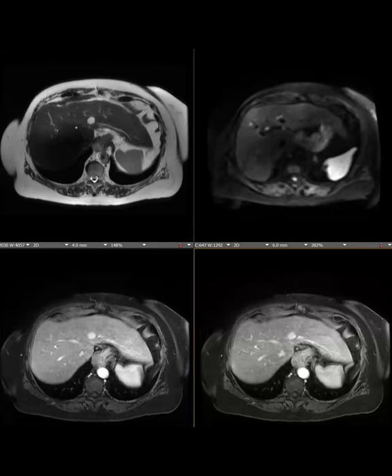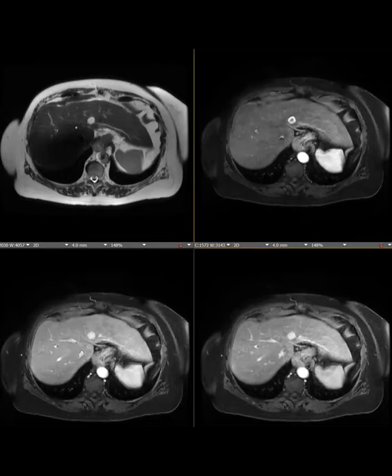Where's my arterial? Enhancement pattern is my least favorite way of characterizing a hemangioma. Yeah, because you can have atypical hemangiomas that look like this, but I guess if you have a background of cirrhosis, you have to. Is it neuroendocrine? This one, path came back to be a biphenotypic HCC cholangio. Wait, that T2 is crazy. Yeah, that T2 is crazy, actually. But it's path proven.